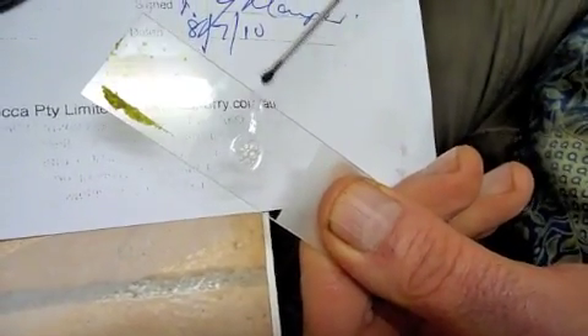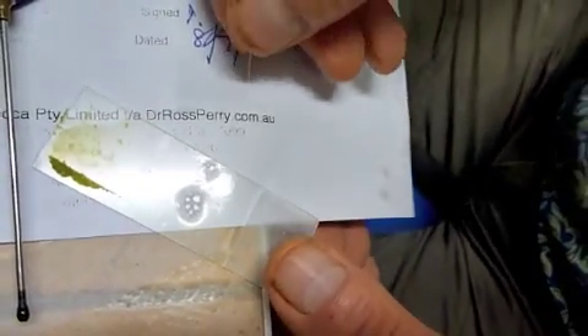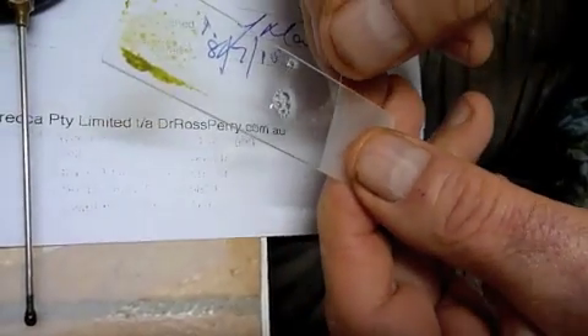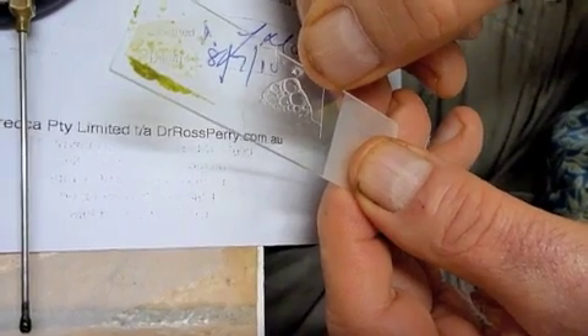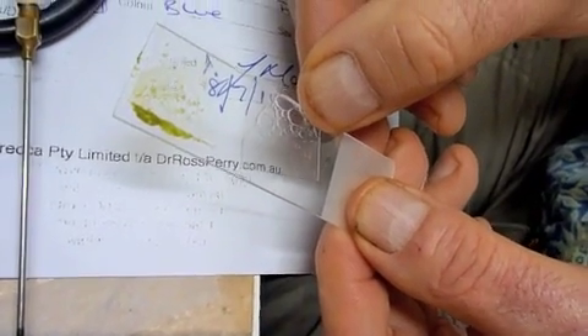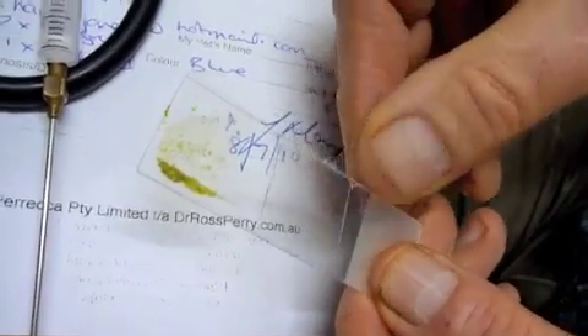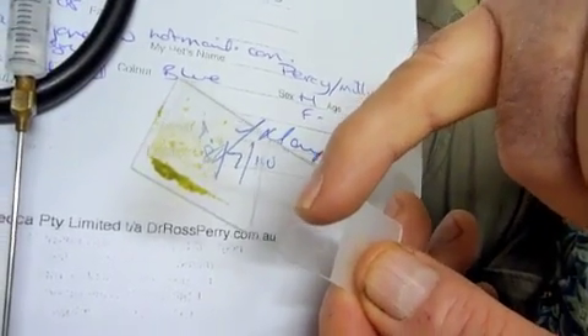I've now got a smear with some bubbles — I don't need the bubbles. I'll get a cover slip and go back. With a cover slip and a microscope slide, I'm now going to gently place that on the edge of the fluid so that the bubbles go out the side. You can see the bubbles gradually disappearing; otherwise I don't want to be looking through bubbles. Just a gentle tap or two and most of the bubbles disappear.